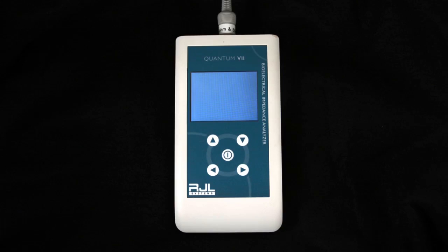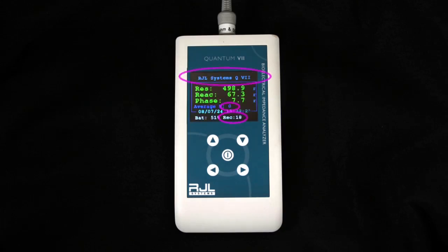The marquee displays the new event time, and the number of averages increases every 500 milliseconds to approximately 2 times the sampling rate. Each time the sampling time expires, all BIA values are saved and time-stamped with the next record number incremented.